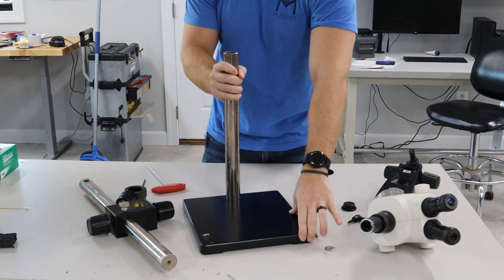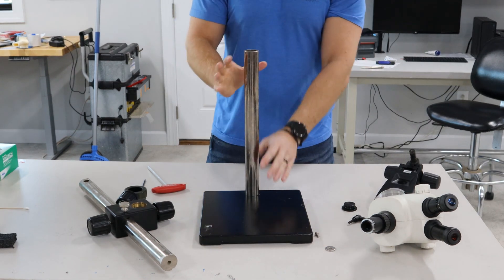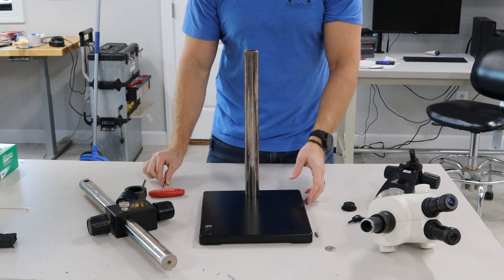Now we're gonna put the whole thing back together. Whenever you receive your box, this post right here will not be on this stand. You'll need a 10 millimeter wrench, which will be included in the box.